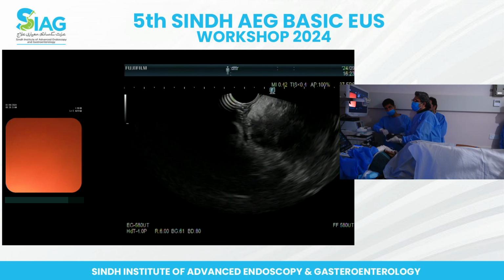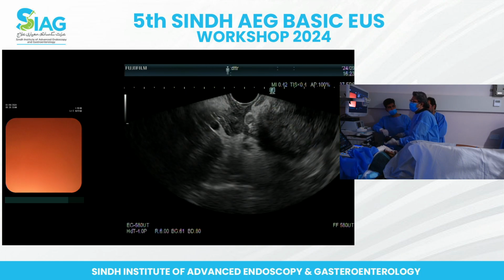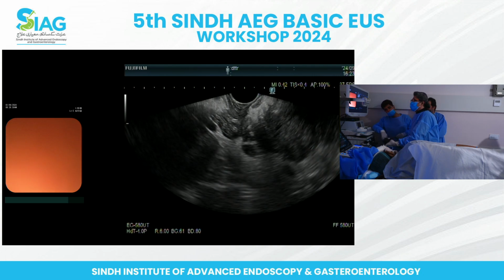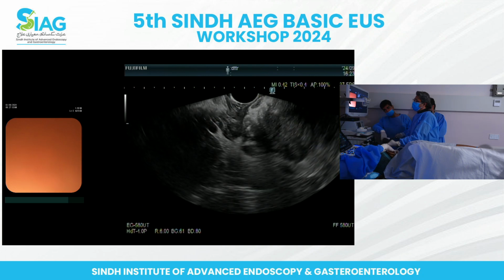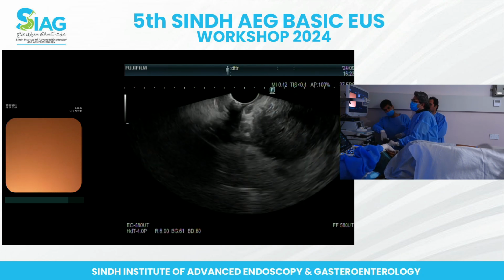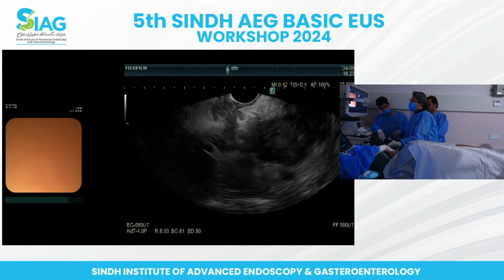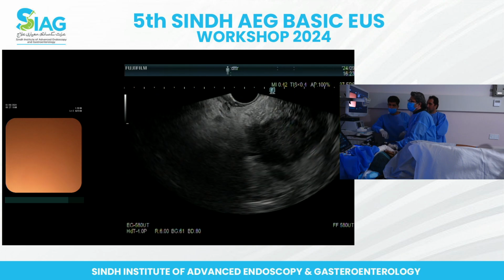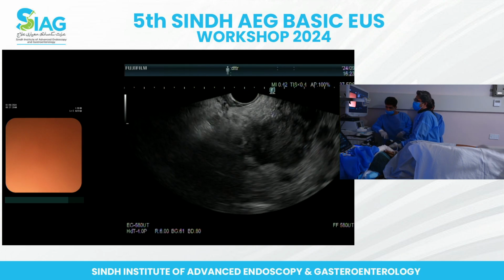The difficulty here is that the scope is at 52, 53 really. So it's just the very last pull that I'm having to do. These uncinate type lesions could be problematic. It looks like a lot of pancreatic tissue in between to get to that.